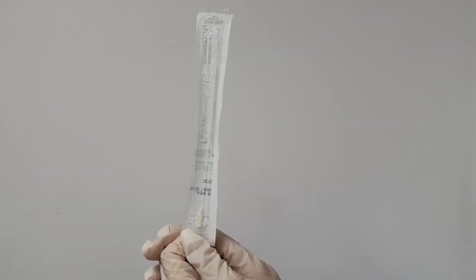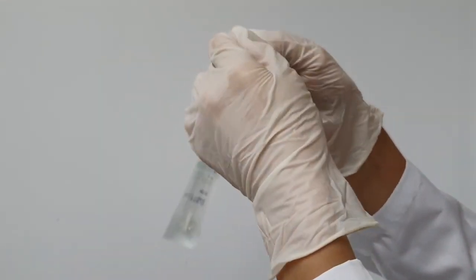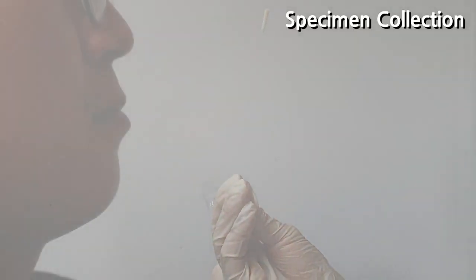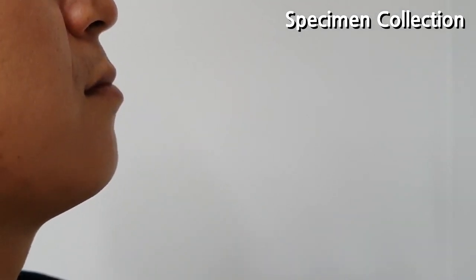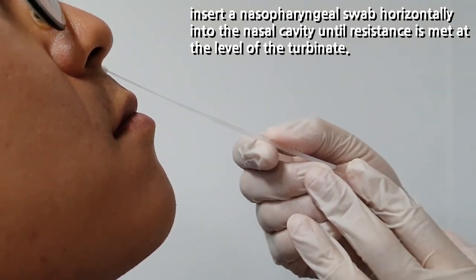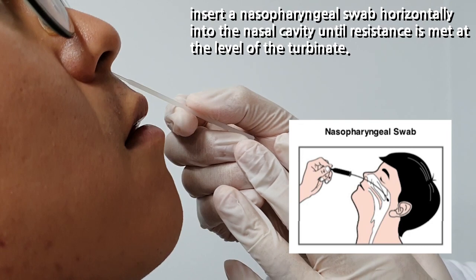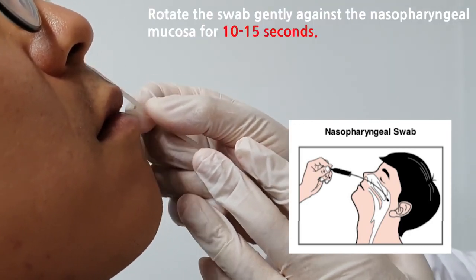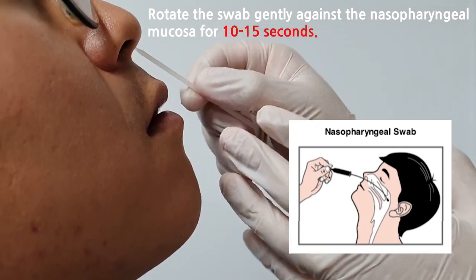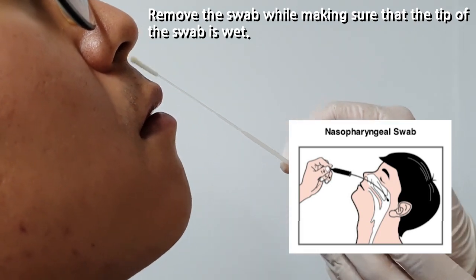To begin your nasopharyngeal swab specimen collection, open the package of the sterilized swab. Tilt the patient's head slightly backwards. Insert the nasopharyngeal swab horizontally into the nasal cavity until resistance is met at the level of the turbinate. Rotate the swab gently against the nasopharyngeal mucosa for 10 to 15 seconds.